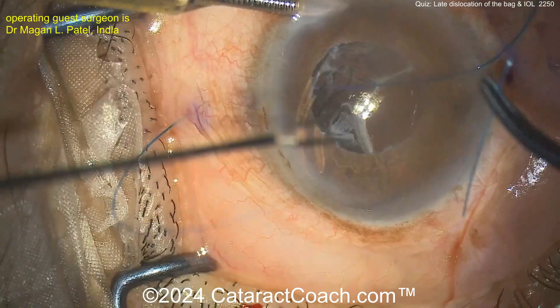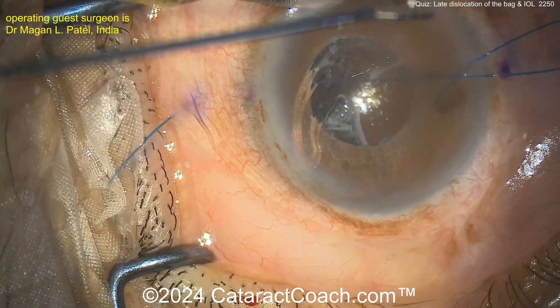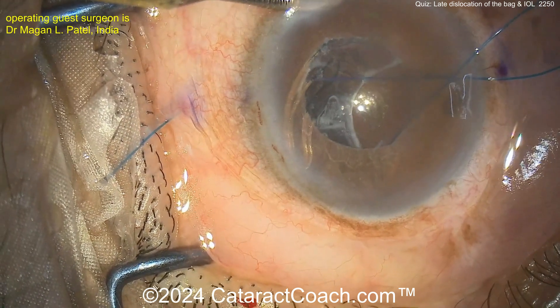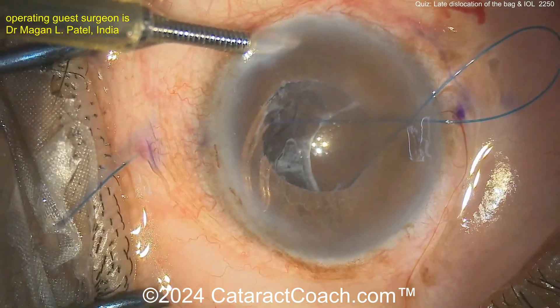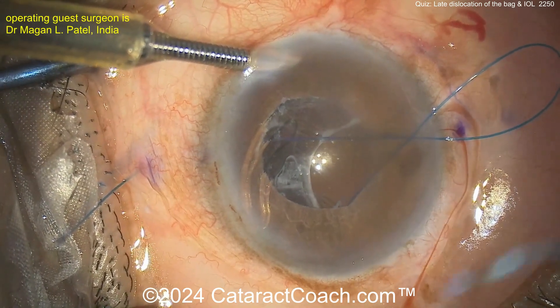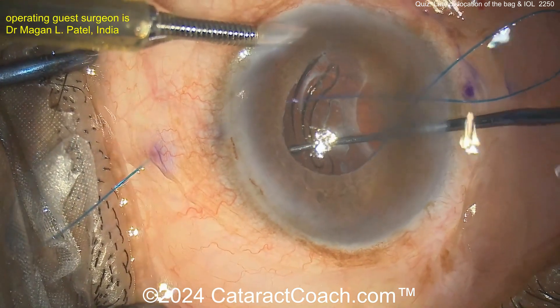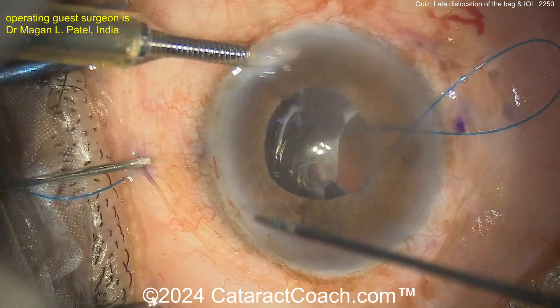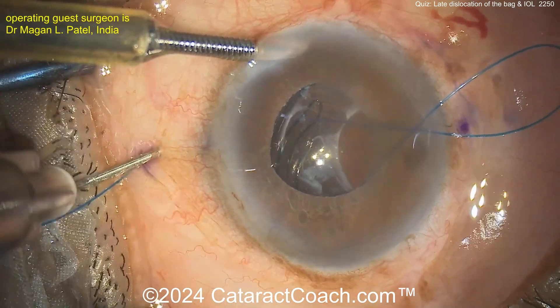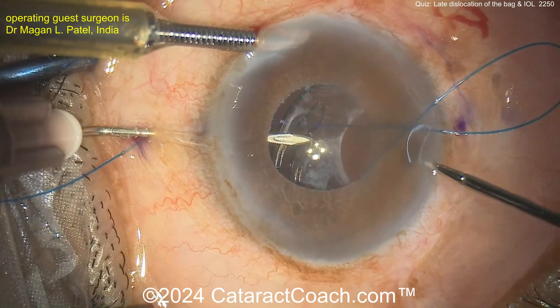Feeding the 6-0 prolene through, bringing it outside the eye. Now the other end is going to go through that same paracentesis — just above it — so now you've created a belt loop around that one haptic. This haptic design is easier because it is a closed loop. Put that back in — going above it — and now you've looped that haptic with the belt loop and it's not going anywhere.